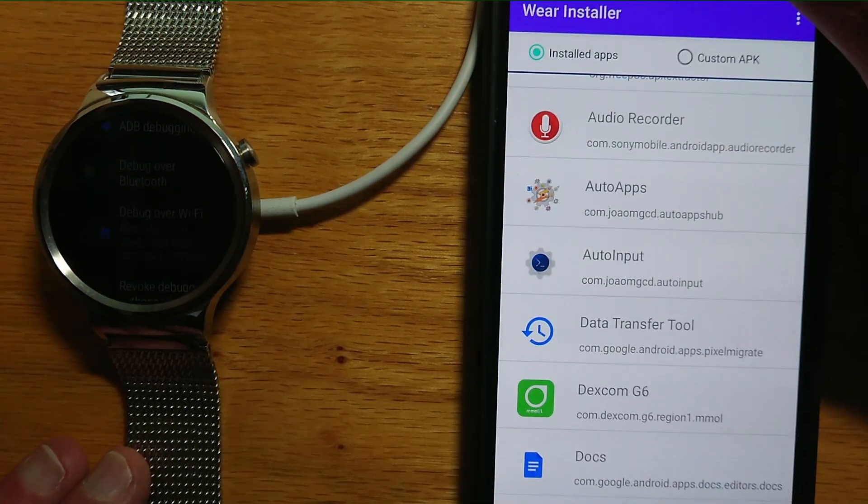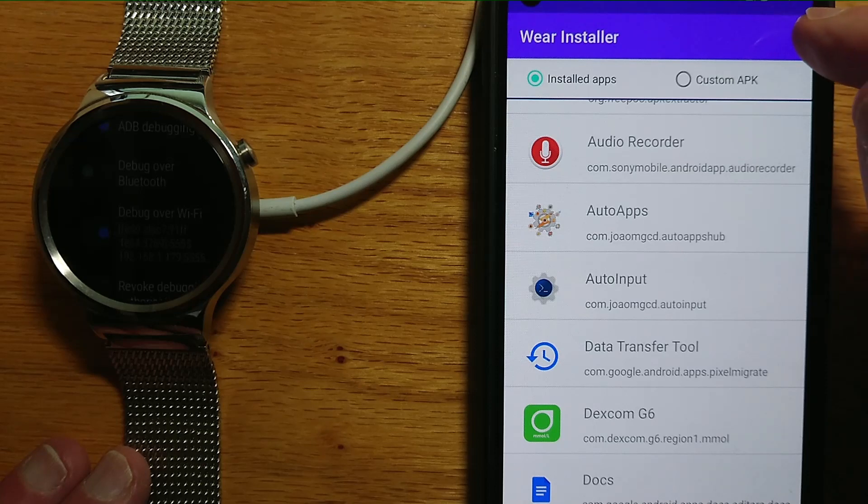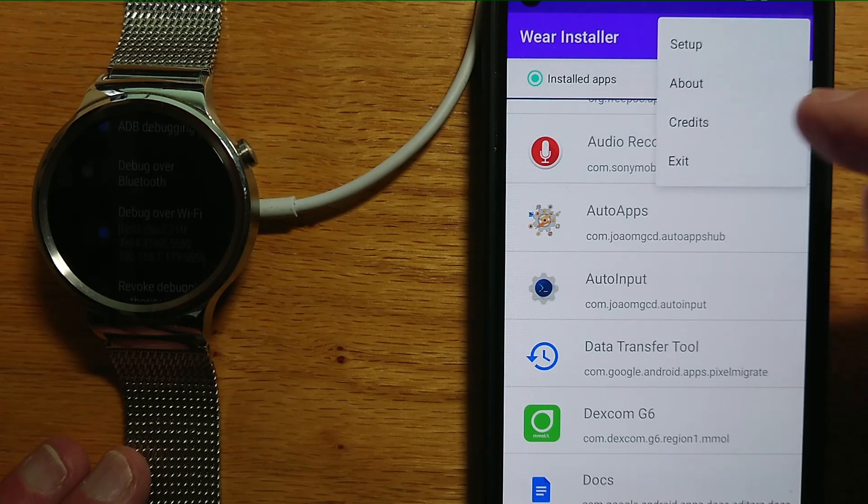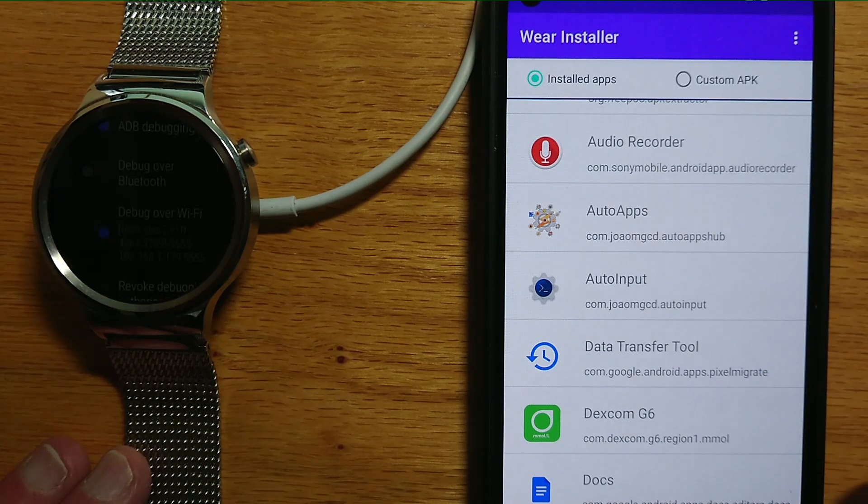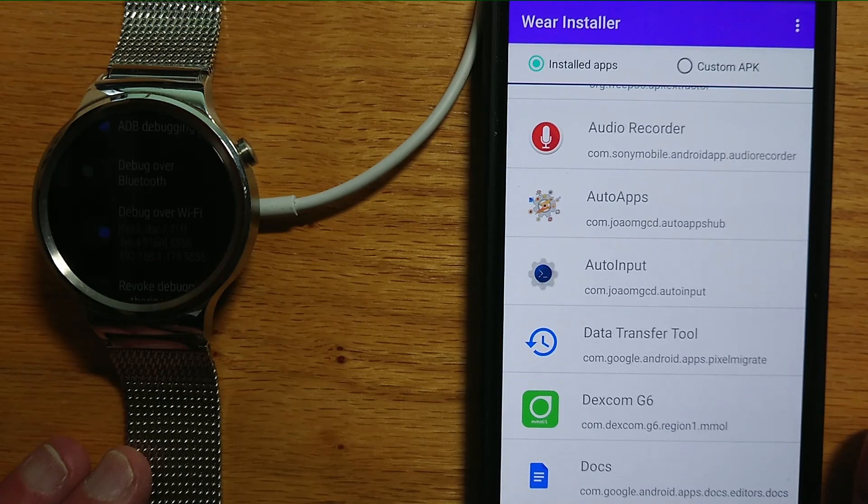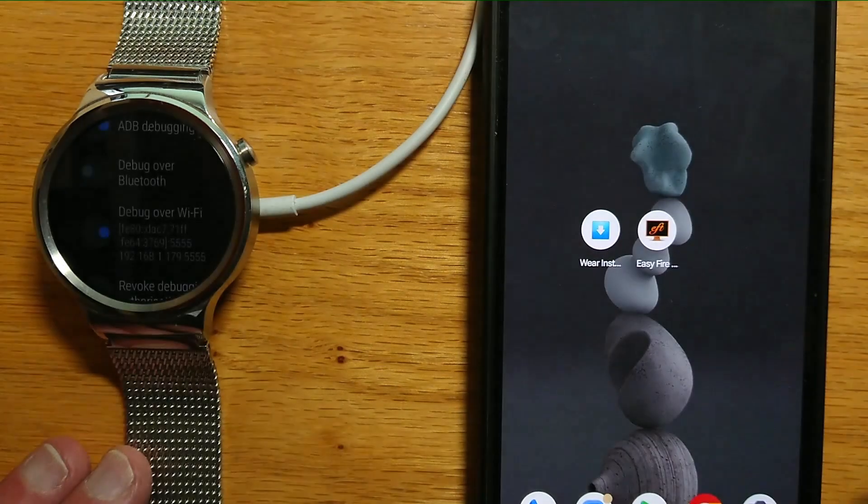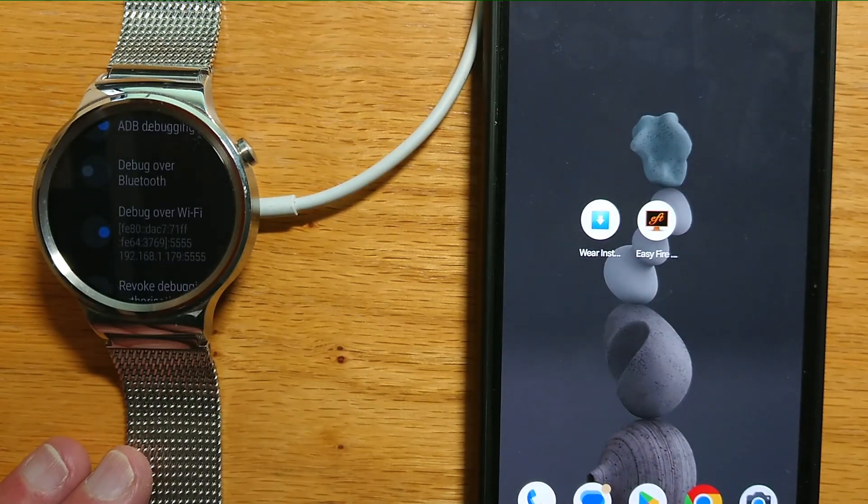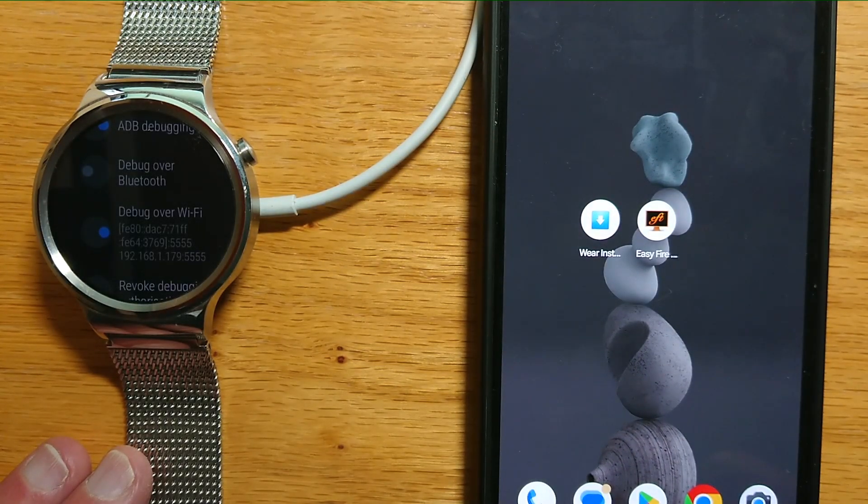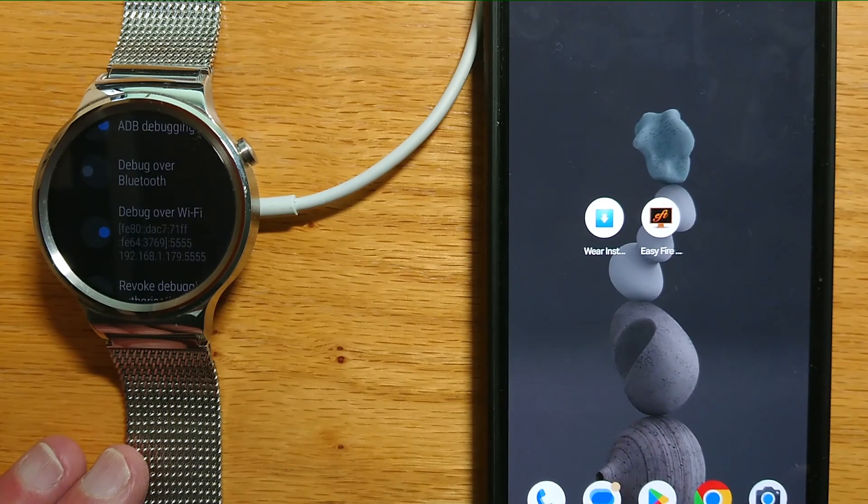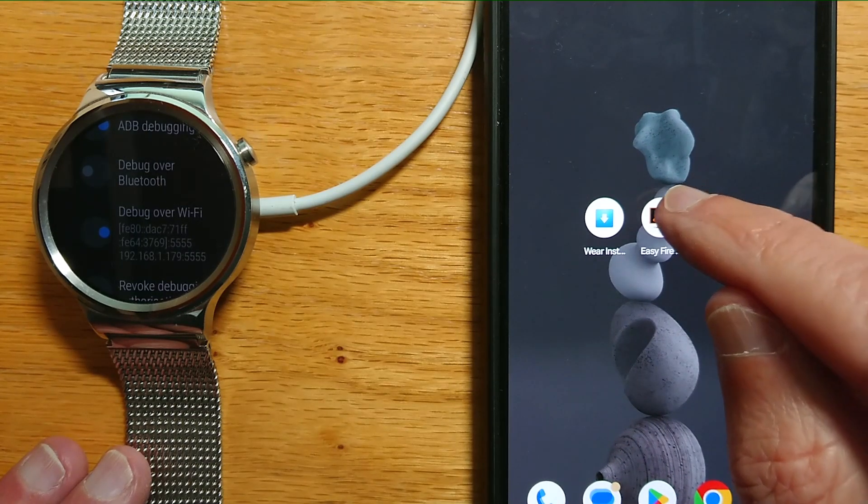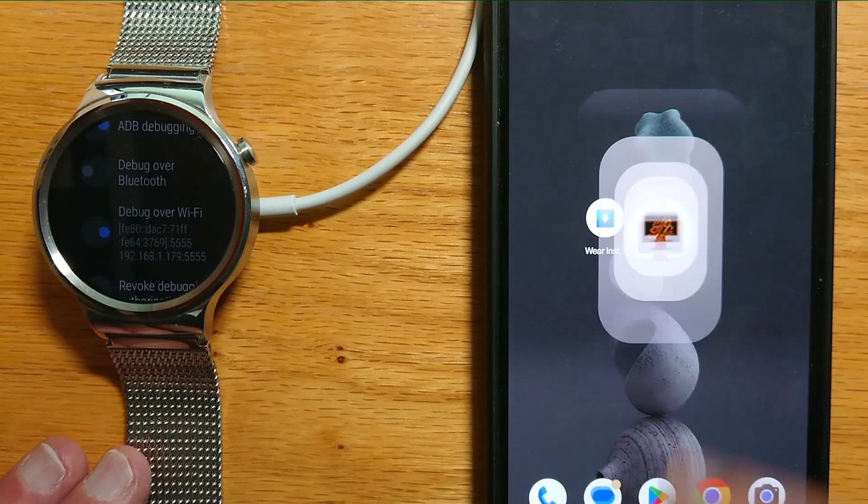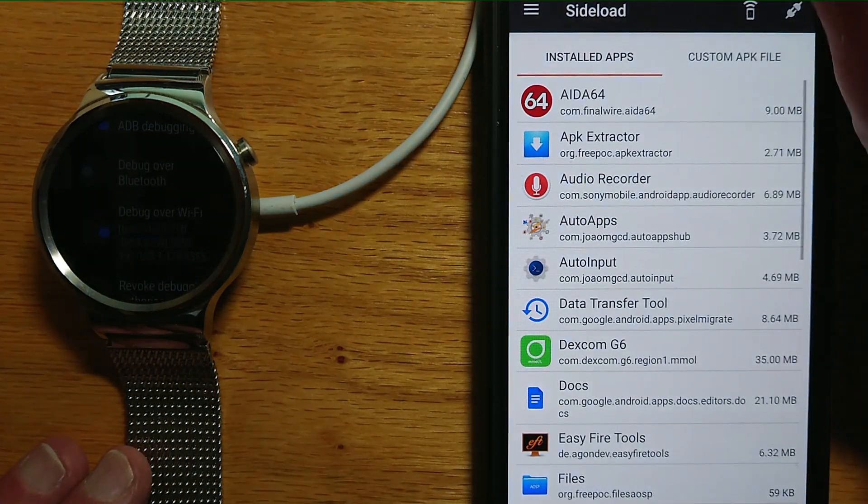Now we're going to come out of WearInstaller and exit. We're going to use another app, not one of mine, but a free app on the Google Play Store called Easy Fire Tools. Let me just enter that app.